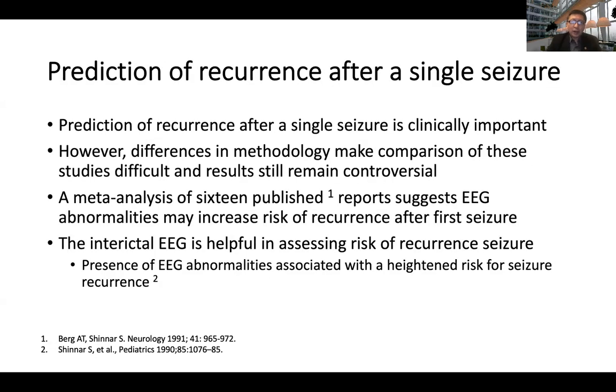How about predicting recurrence after a single seizure? Prediction of recurrence after a single seizure is clinically very important. However, differences in methodology make comparison of these studies difficult and results remain controversial. A meta-analysis of 16 publications suggests EEG abnormality may increase the risk of recurrent seizure after the first seizure. So the interictal EEG is helpful in assessing the risk of recurrent seizure.